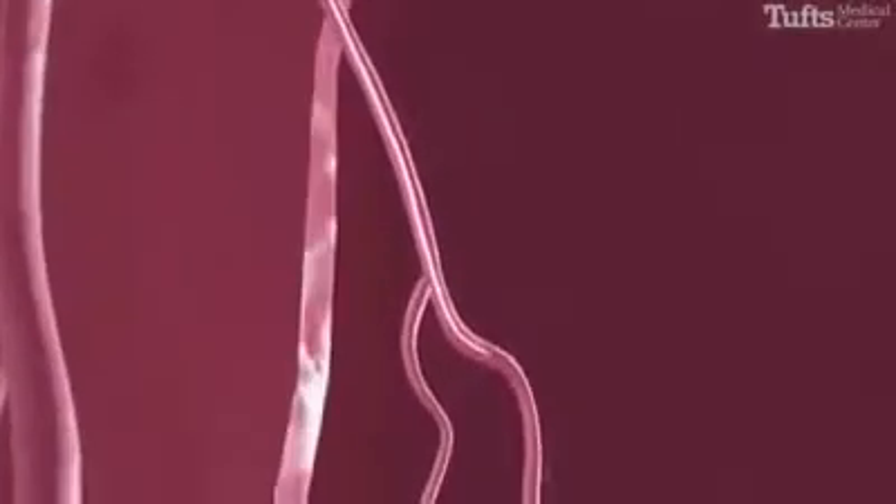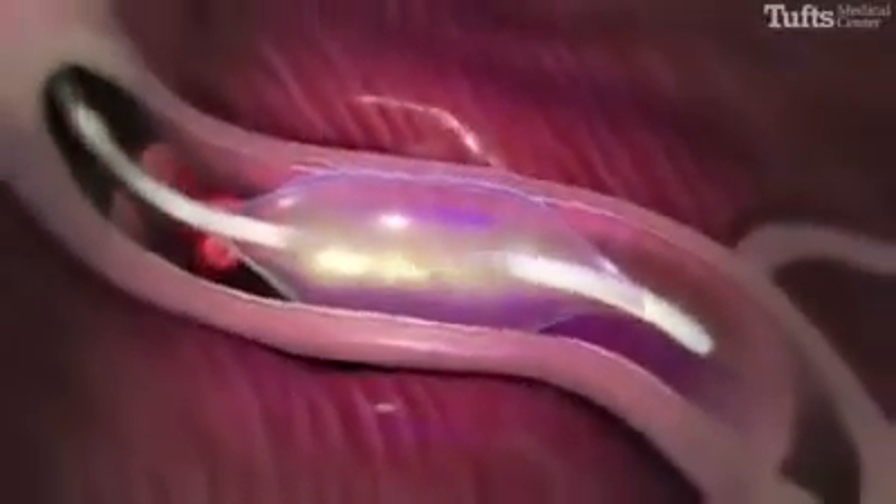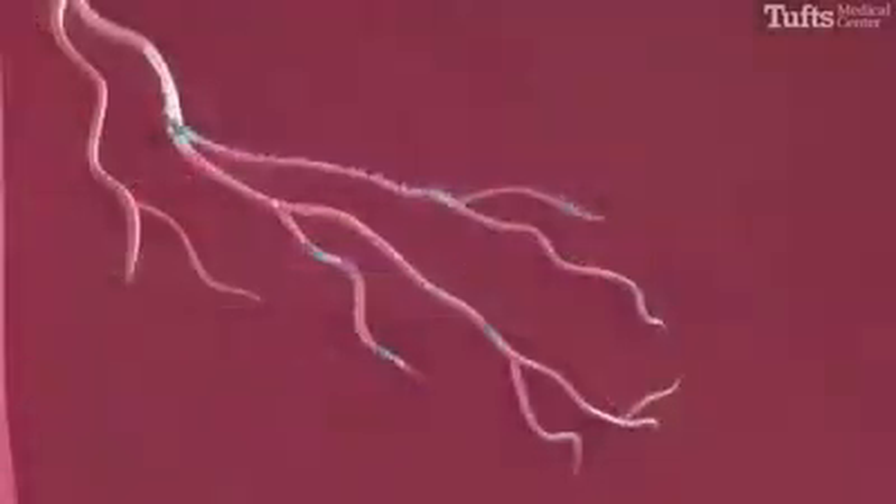Once the catheter is properly positioned in the septal artery, a tiny balloon at the tip of the catheter is inflated, blocking blood flow. One to two cc's of absolute alcohol is then injected through the catheter and into the septal artery.